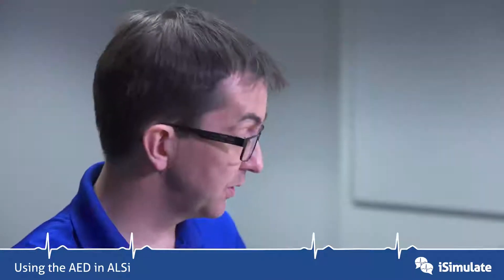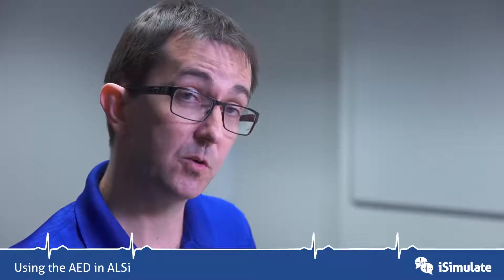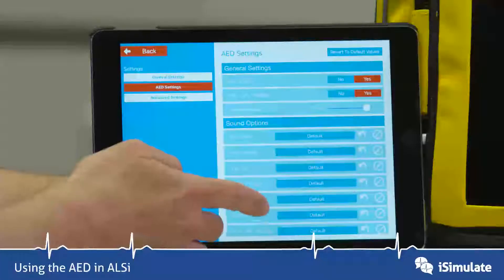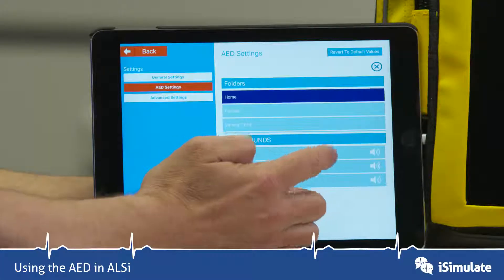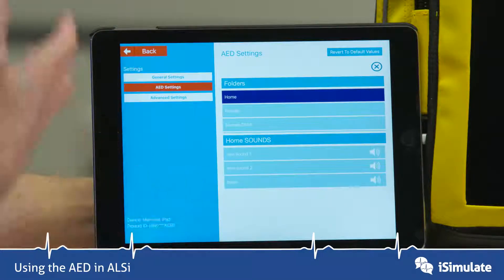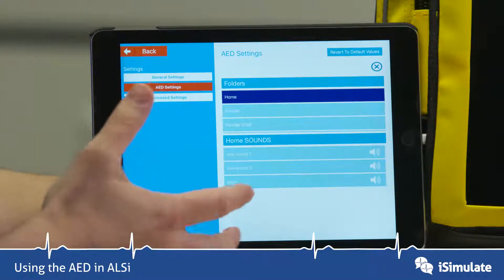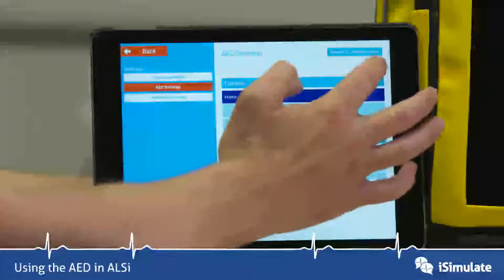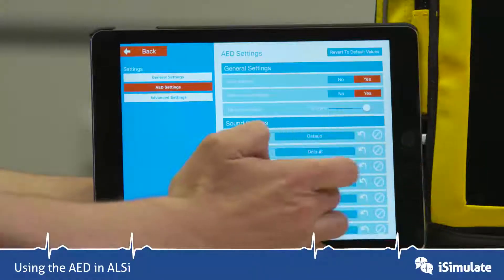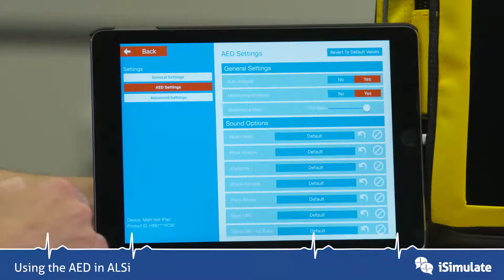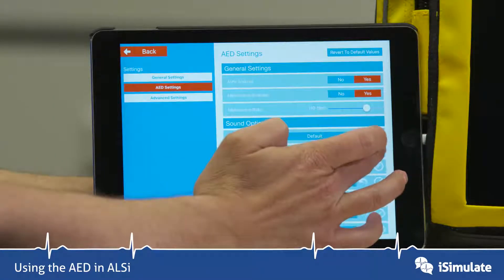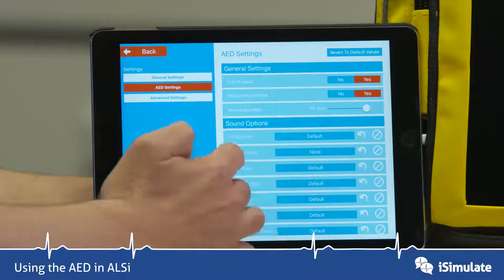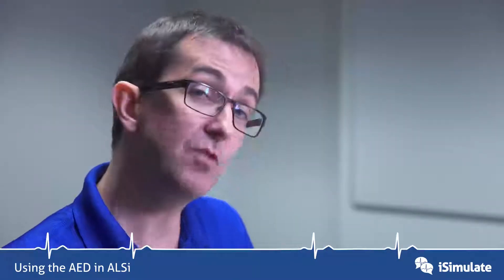You can also change all of those sounds and voice prompts that you hear. You can press in here and it goes into the sounds menu, where you can record your own sounds and it will change to whatever voice prompts you actually want. You can also turn off the voice prompts entirely, including the analyze voice prompt. So you can really customize the AED for whatever your local settings are.